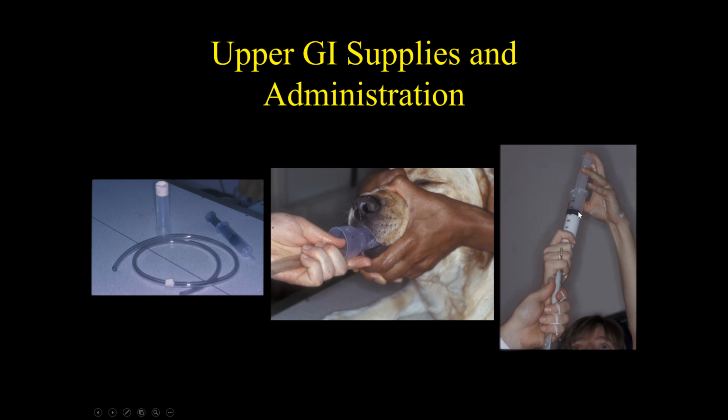And you have them all ready to go, and you slam it as fast as you can. Okay. And you inject it into the stomach, pull the tube out, and then start shooting your x-rays.